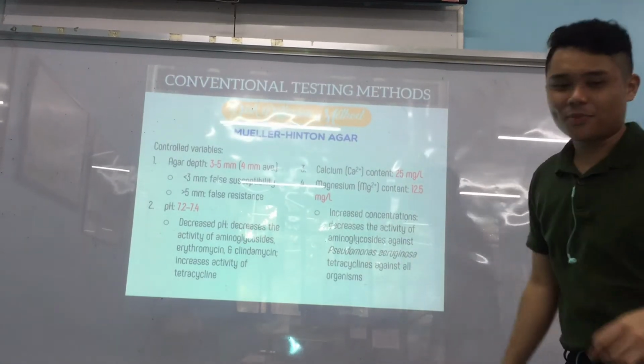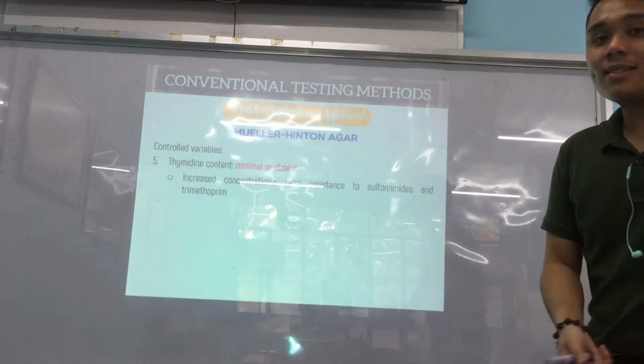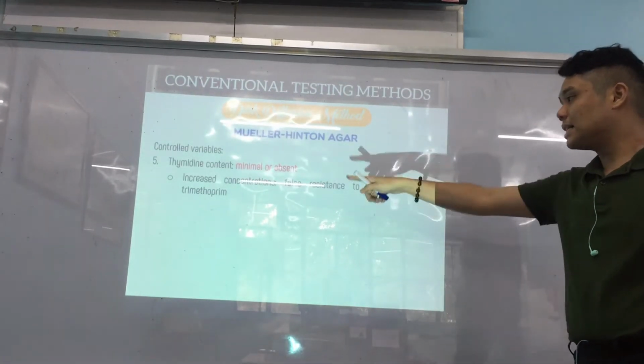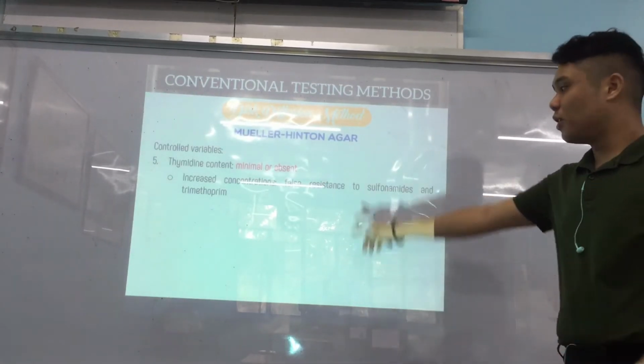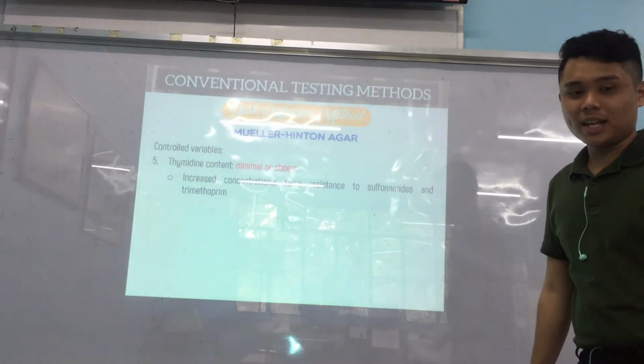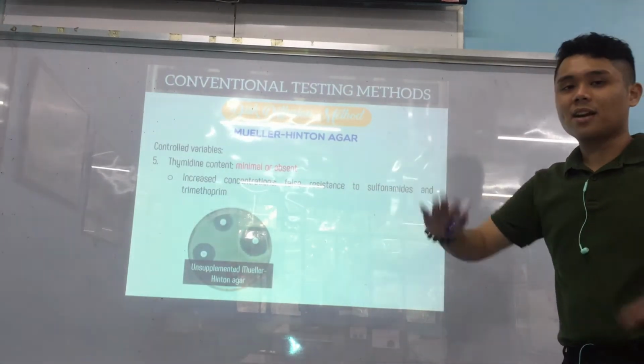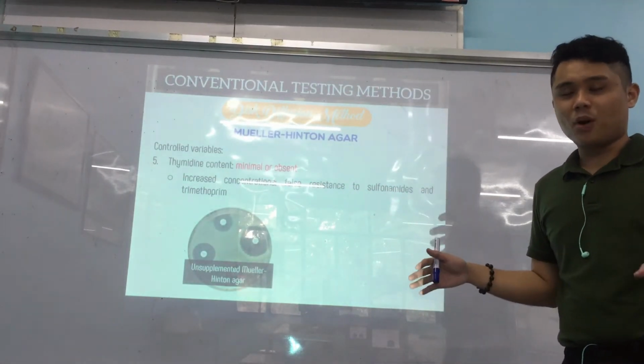Okay. Alright. Another one is thymidine content. Okay, it should be minimal or absent because increased concentrations will lead to false resistance to sulfonamides and trimethoprim. So another type of antibiotics. Okay, so as you can see, this is unsupplemented MHA, kana ra yung normal na ginagamit for MHA.